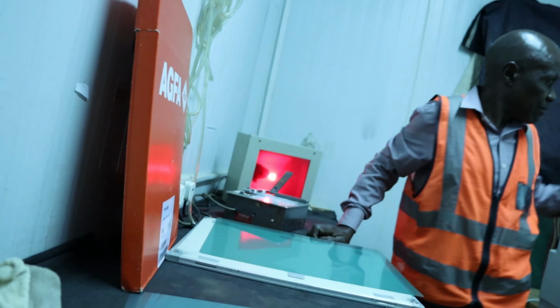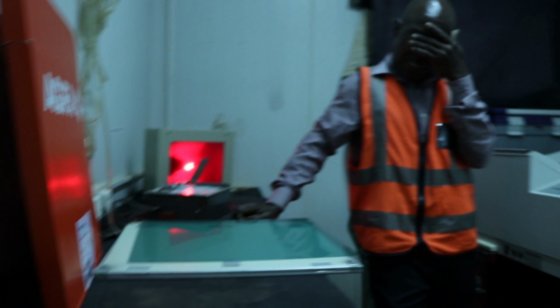Closing the cassettes. Closing the box. Closing the feeding tray, you may switch on. I'm switching on the light. It looks so simple but is not, for it calls for extra care and sensitivity to execute this task effectively and efficiently in the dark.